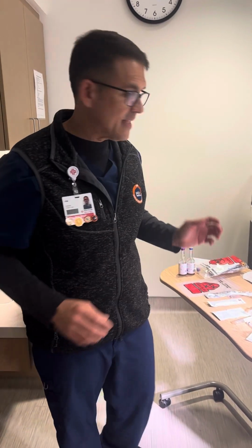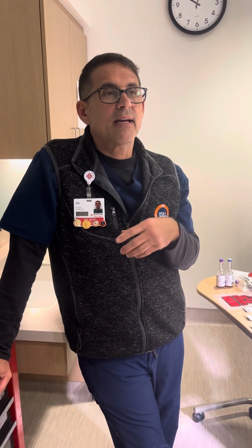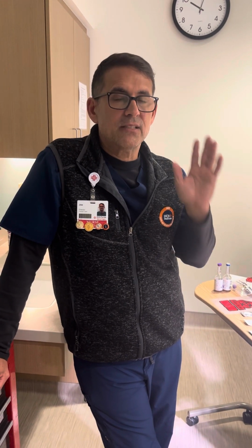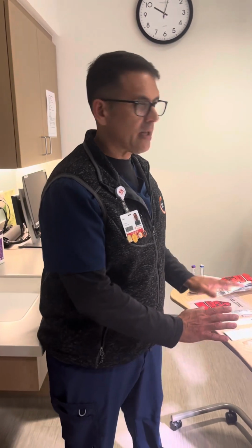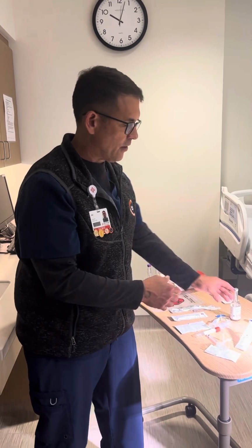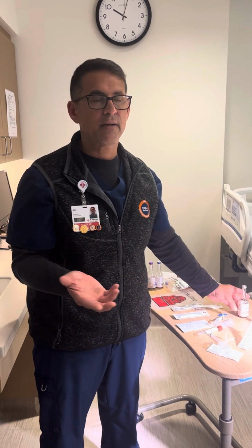All right, the number one thing about blood cultures is, if you remember when we went to school, and we took micro and we grew all the bacteria in the petri dishes, it takes literally just 1 bacteria to multiply and to cause contamination. So a blood culture draw is a sterile process, but it's done not in a sterile field. So you have to be really careful with what you're touching and with where you're putting all your equipment. I would never do a blood culture and put all my equipment on top of the bed. I want it on top of a table, because if it's on the bed, it falls over and it touches something there, you're contaminated, you're done. And we want a 0% contamination rate.